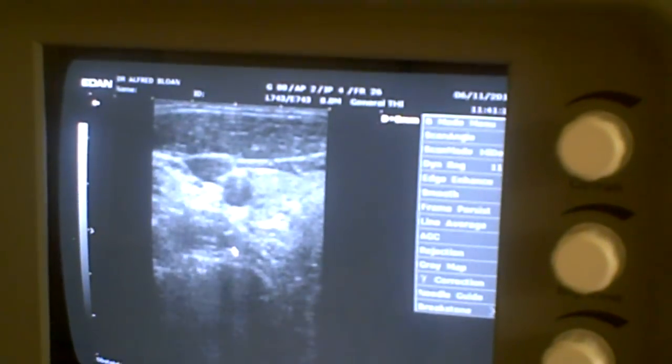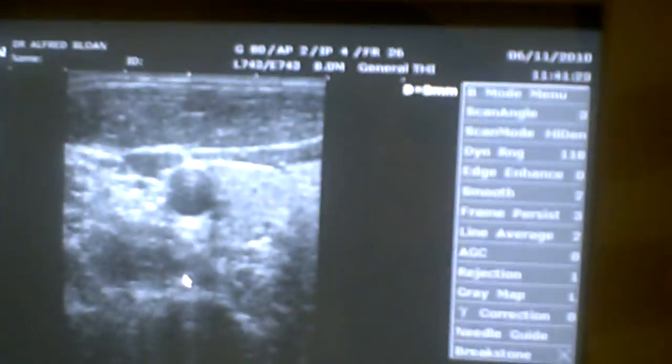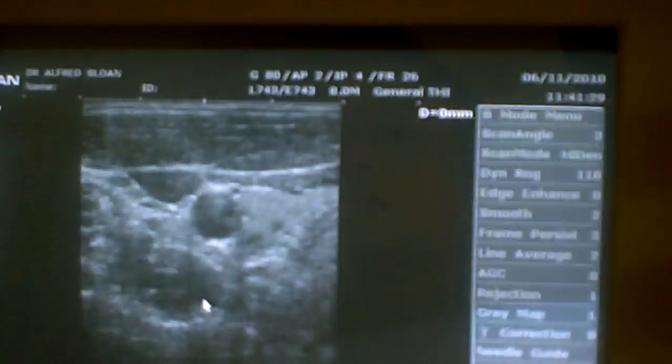In this segment of training, we're using a linear array transducer on the DUS-6 to image the thyroid. Go ahead and point out the thyroid for everybody. We've got the thyroid — what else are we able to see on the screen here?